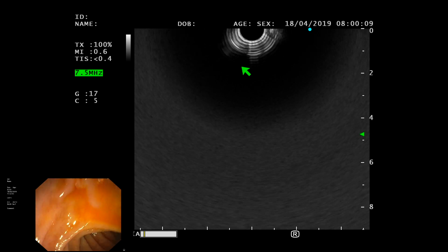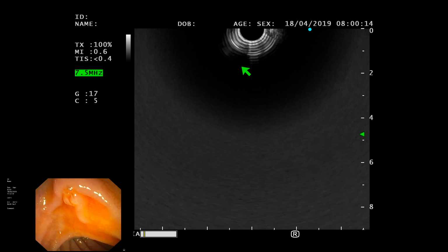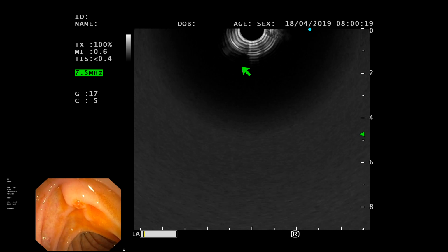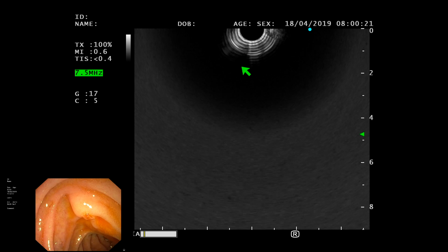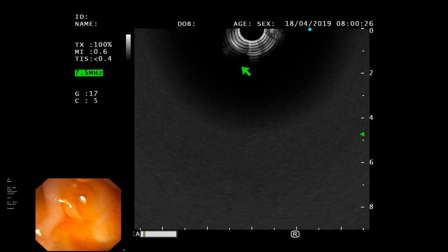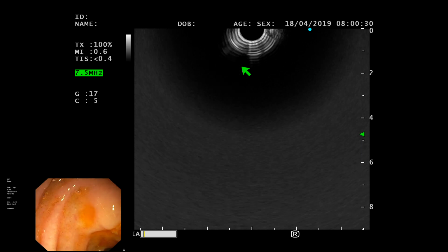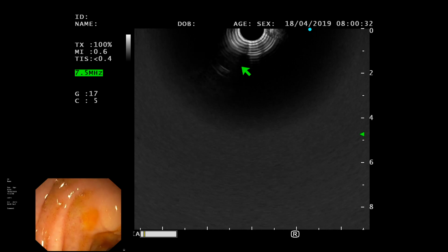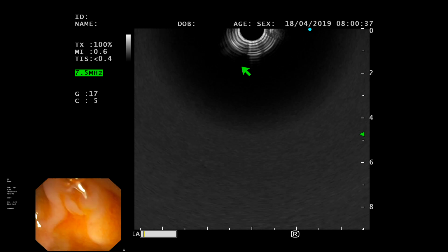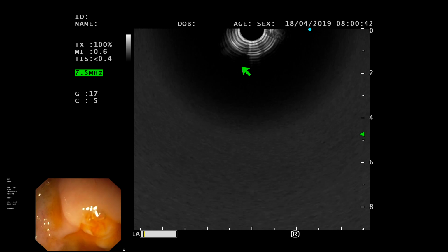First thing I'm going to describe, if you see the papilla, is how to do a D2 exam or ampullary exam or uncinate process exam. Look at the papilla. Khalid, normally you don't see such nice views of papilla, do you? It's a big cyst, so it's compressing on those areas, and it becomes very prominent. That's why we're not able to see anything from the duodenal bulb, because everything is pushed away by the cyst.